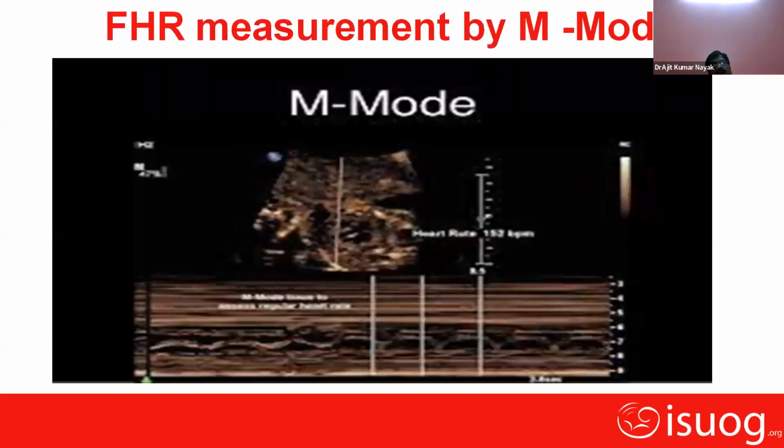First we locate the heart and try to find the four chamber view of the heart. Then we put the M mode cursor over the valve of the heart and we get these waves. Some ultrasound machines are set up so that to measure the heart rate, we measure from one peak of the wave to another peak, as shown here. But in some machines, we have to skip one wave to know the exact fetal heart rate of that patient. So this is the M mode interpretation to know the fetal heart rate. This is about step 2.